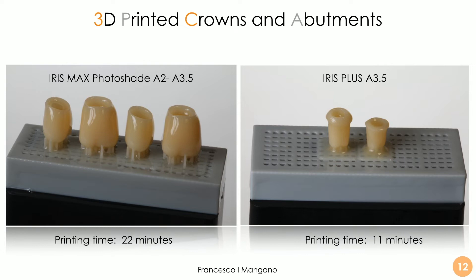We printed in two different sessions. In the first session we used Iris Max photo shade A2-A3.5 for the crowns, and in a second separate session we printed with Iris Plus A3.5 for the individual abutments. The technology is super powerful and we can obtain the crowns in a very short time frame — 22 minutes overall for four crowns. We can also print up to five crowns in this machine, and only 11 minutes for the individual hybrid abutments.